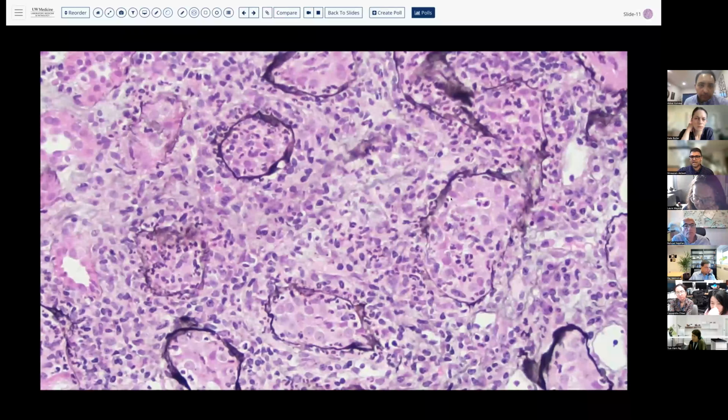Just to emphasize the fact in terms of that sharply demarcated area of inflammation, we have tons of these neutrophils, which look like almost these little black ants that are crawling across the biopsy. They're invading into and destroying the tubular basement membranes. This is associated with some interstitial edema, which is this kind of lighter gray area. And you can see the tubules being pushed apart by this inflammation as well.